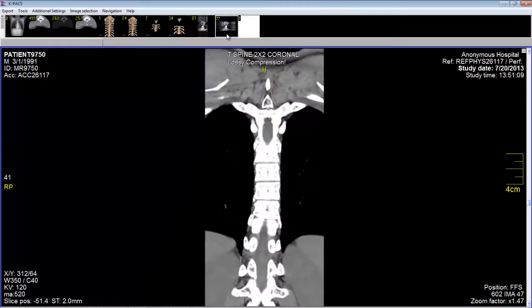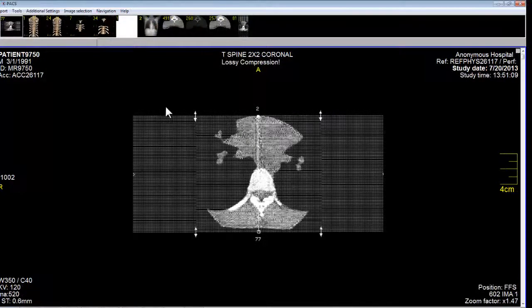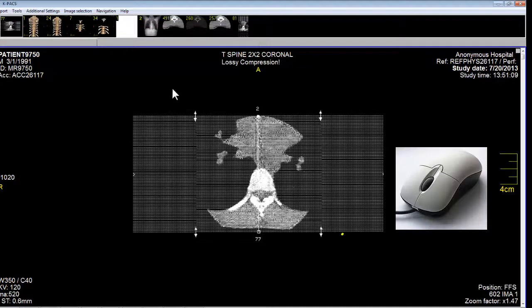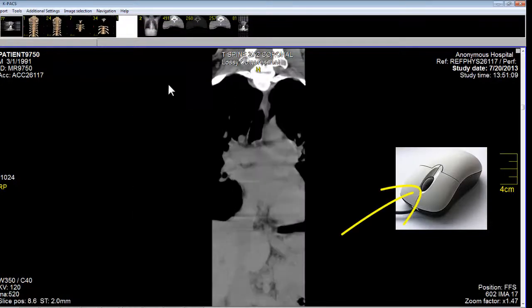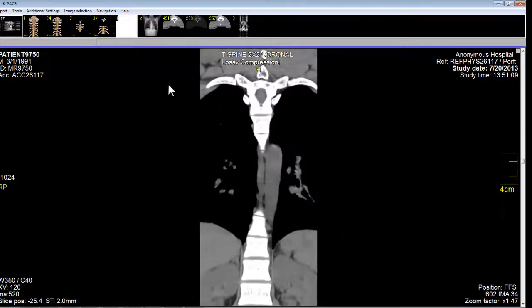In this T-spine coronal stack, you notice there's a number 77 up in the left-hand corner. What that means is that there are 77 slices in the stack. To see individual slices, if I put my cursor in the middle of the screen and scroll the wheel, I will scroll through the image stack from top to bottom.